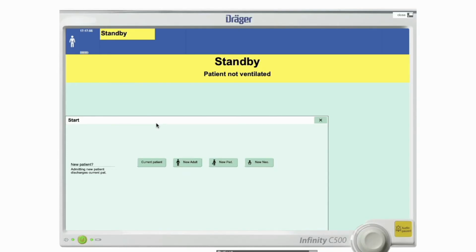Okay, people, when the child comes back from theatre, several things will be on your mind and lots of things will be happening at the same time, all of which you need to keep your eye on. So a bit tricky, but you'll get used to it over time. So one of the first things you need to decide is what's happening first. Are you going to leave the patient on the bed on which he's arrived on and take handover while he's still on the transport vent?